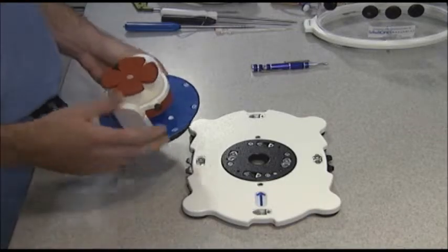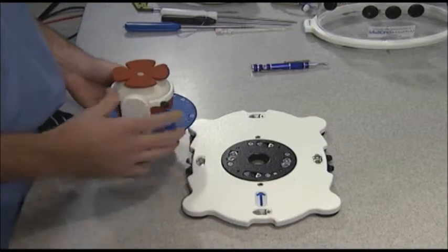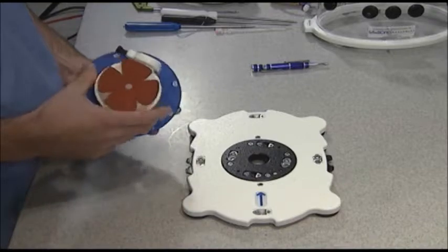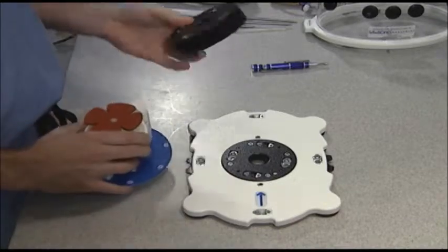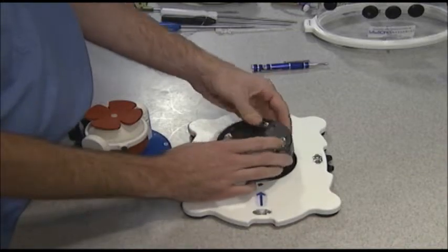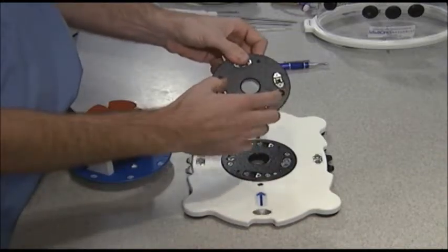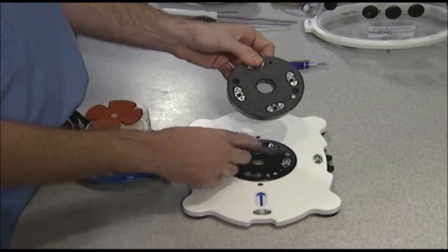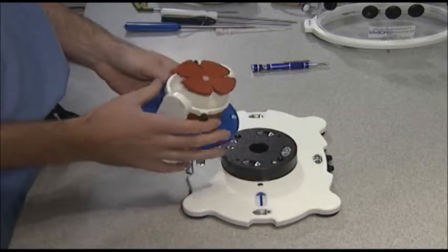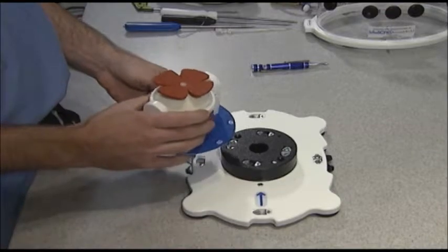Before starting the module, I'd just like to talk about the actual FAST workstation a little bit here. This module has a little bit of a fiddle to putting it into place. The first thing that you'll need is the 1-inch puck that you can affix to the station. You want to make sure that the screw holes in the puck line up with the screw inserts in the station. And then when we look at this module, it has a lot of versatility built into it.